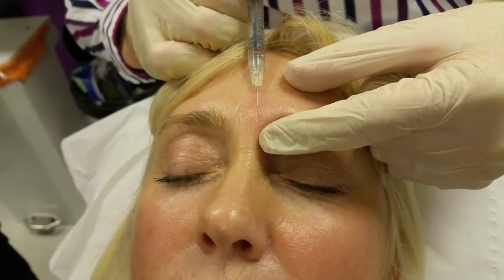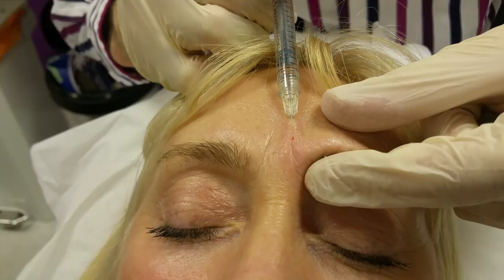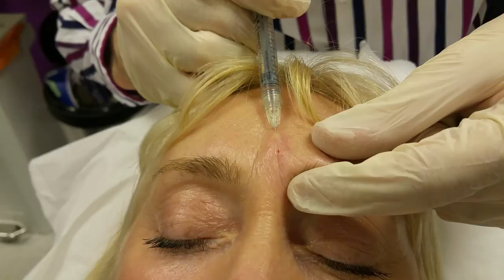Then we do the same a little bit higher up — exactly the same process. Superficial injection, tent the skin slightly, slide it in, aspirate, compress the artery, fill backwards. Going in slightly more superficially on top — there are like two layers with that one. And then fill back.